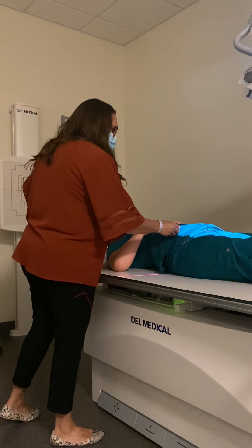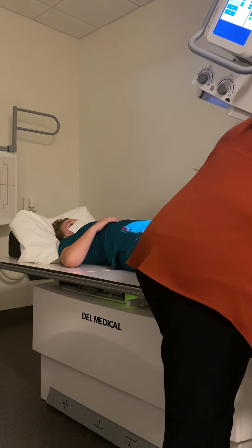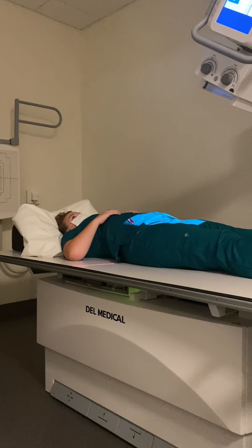I'm going to put my right marker on the side and make sure that my patient is nice and straight. I would have my patient hold their breath and suspend respiration for that AP SI joint.